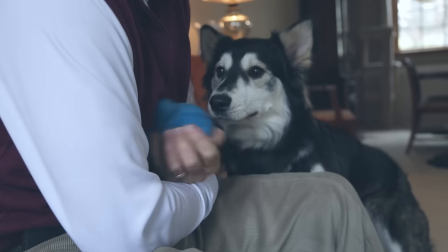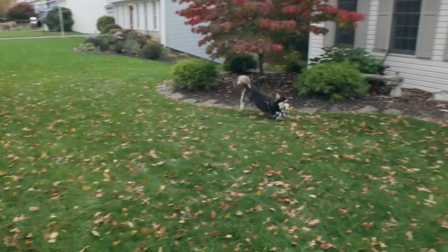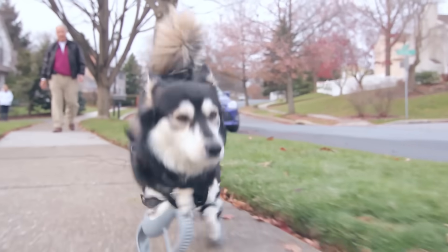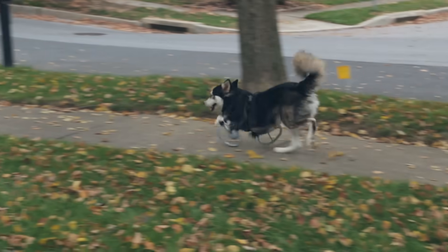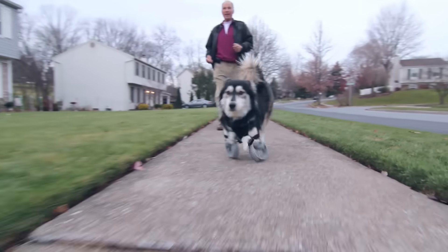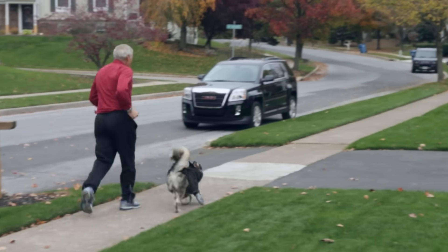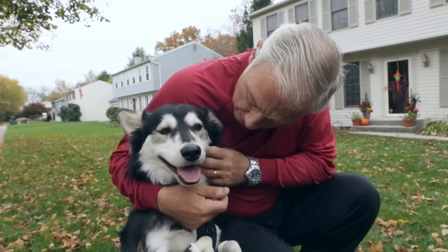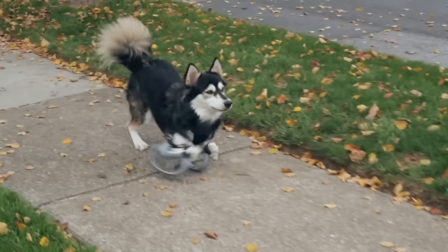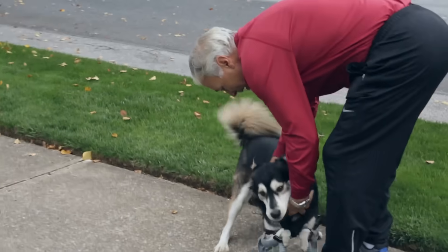I don't become impressed very quickly, but when I saw him sprinting like that it was amazing. I just couldn't believe it. The first time he was put on them and he took off running, he was just so happy. I was absolutely amazed at how well he did. He runs with Sherry and myself every day, at least two to three miles. He runs faster than both of us. He never really tires out. He's just so happy to do that.